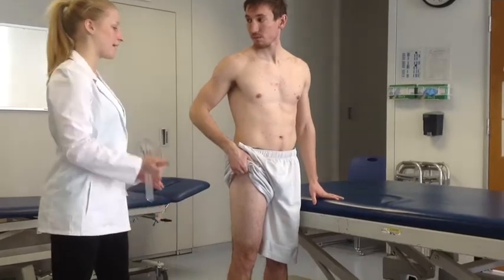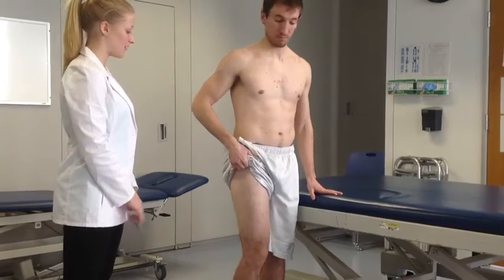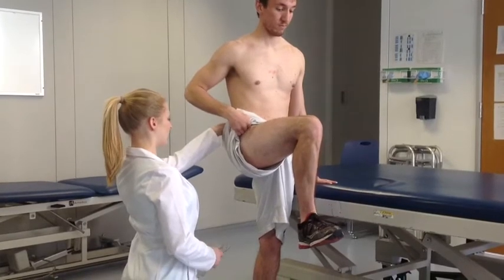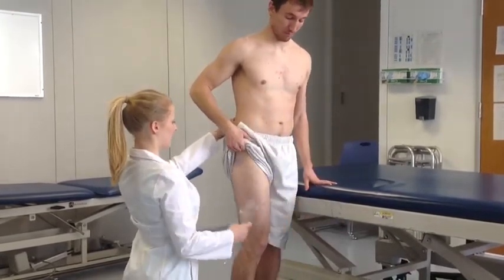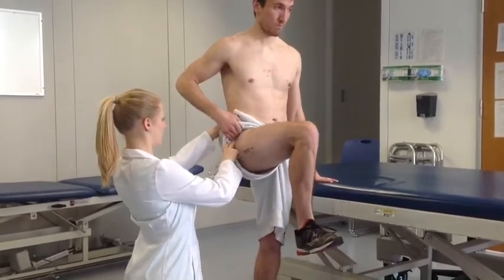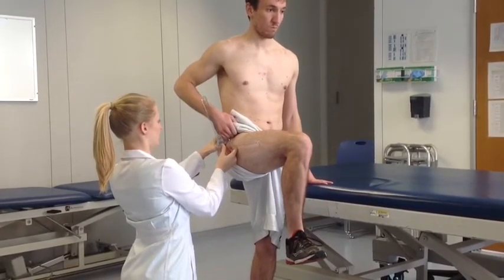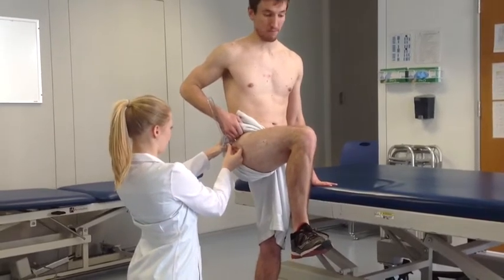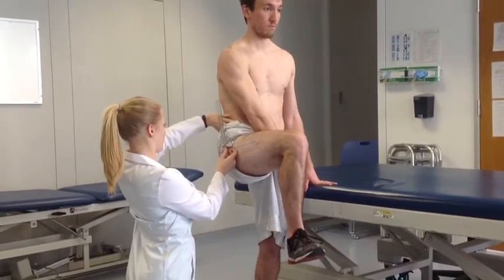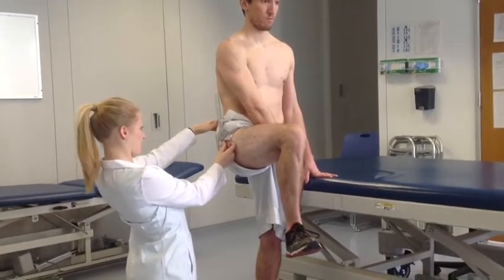I'm expecting to see your knee come about hip level, maybe a little higher, but we'll see where you're at. Measurements below expected for a particular patient in hip flexion could indicate several conditions: the gluteus maximus may be tight, limiting flexion range of motion; certain joint surface abnormalities may also contribute; a tight posterior joint capsule will limit hip flexion; and femoral acetabular impingement may result in loss of flexion range of motion, as the bony pinchers act as bony blocks for normal hip movement.